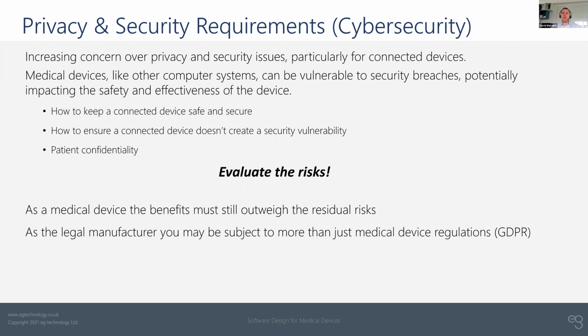One of the easiest ways to do that, of course, is to make sure that your device totally stands alone, is totally isolated, but increasingly that's not really possible, because new devices potentially rely on cloud-based functionality, on data collection to improve and expand algorithms, and if you're earlier in the market, things like clinical trials and those sorts of things, obviously data security is equally important.